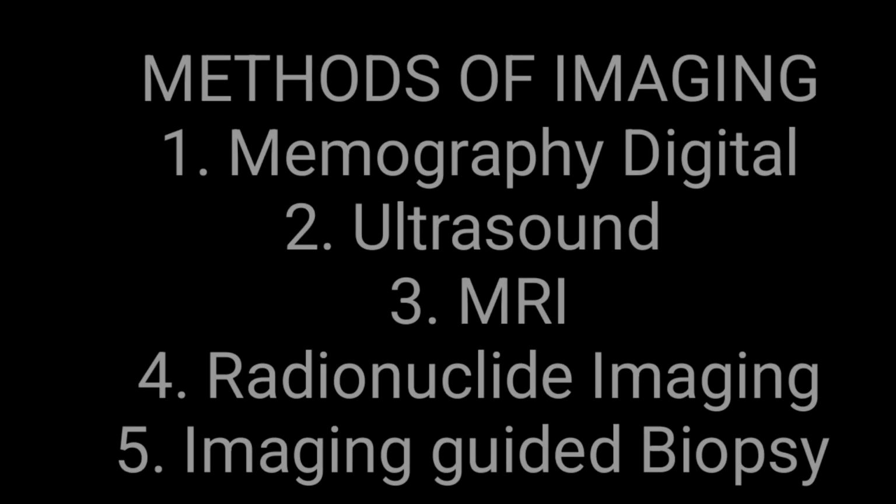For certain abnormalities, including cystic lesions or solid lesions, and on top of it, so far as the metastatic status of the carcinoma is concerned, MRI is the best method to see and localize the lesion and its extension, and involvement of the retromammary space, anterior chest wall, surrounding lymph nodes, or distortions of the soft tissue component. So third in the line of imaging methods is the MRI.